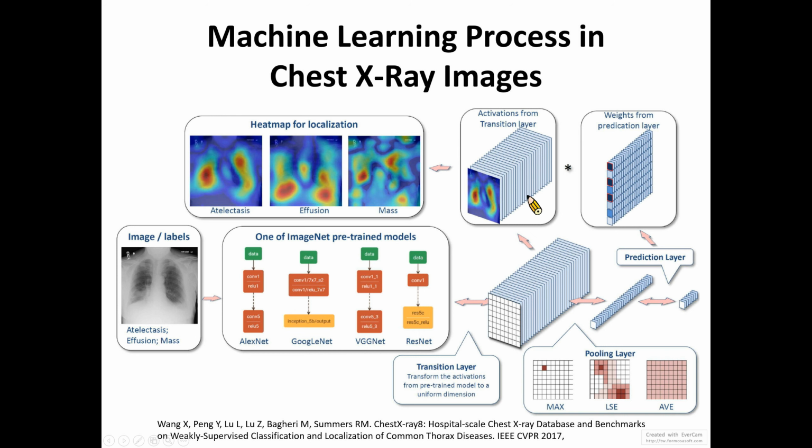Okay, this is another paper, titled Diagnosing COVID-19 Pneumonia from X-ray and CT images using deep learning and transfer learning algorithms. So again, transfer learning is a very important technique because we can use pre-trained models to reduce the training time.